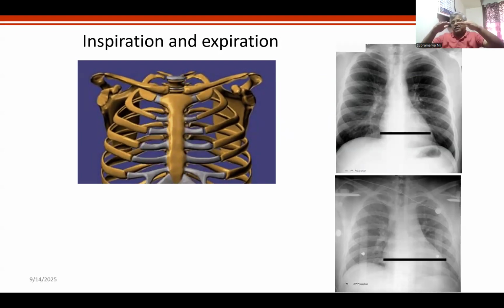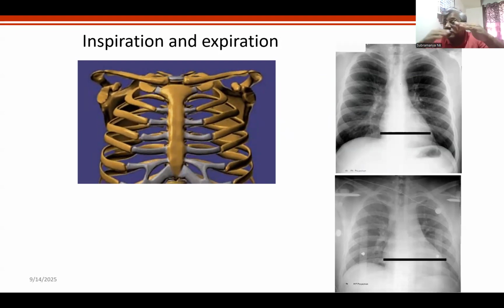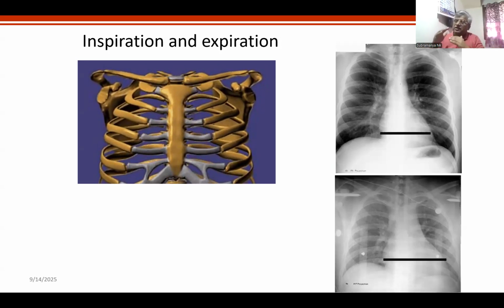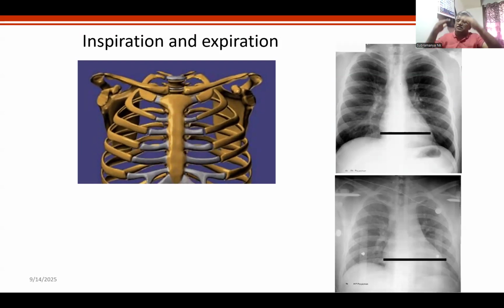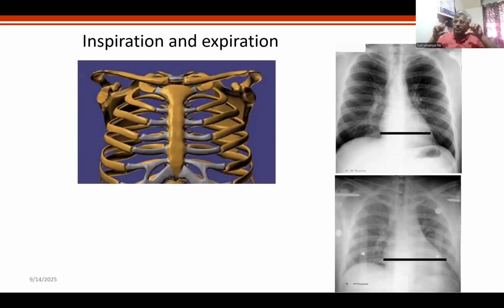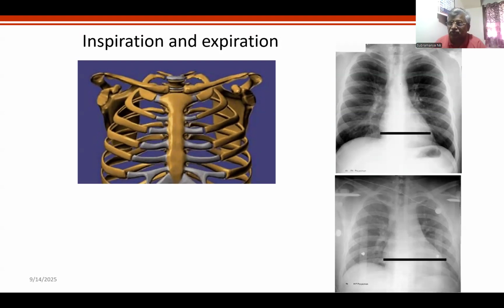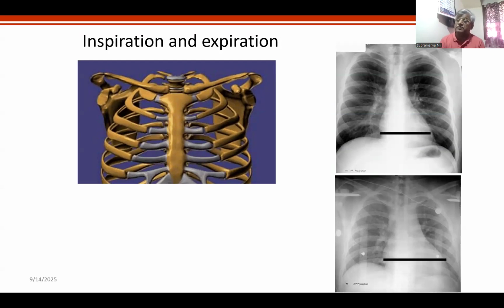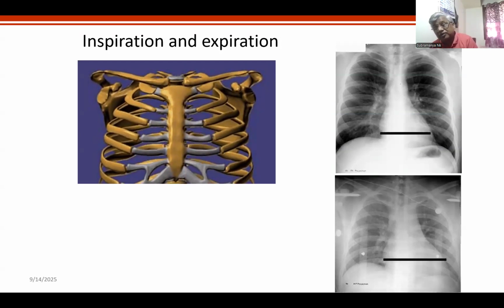But a child can be mid-inspiratory, closer to the inspiratory, closer to the expiratory, mid-expiratory. You understand my point? It can be in any phase of respiration. You have taken a photo, click, X-ray, shoot. At that point of time, it can be closer to an expiration or closer to an inspiration. It may not be a perfect expiratory film also.